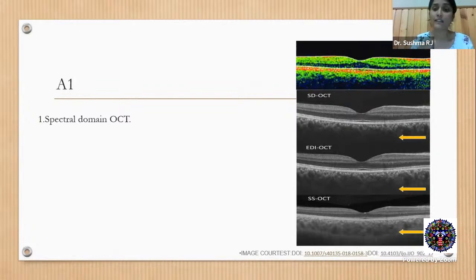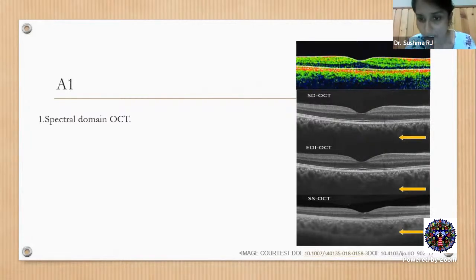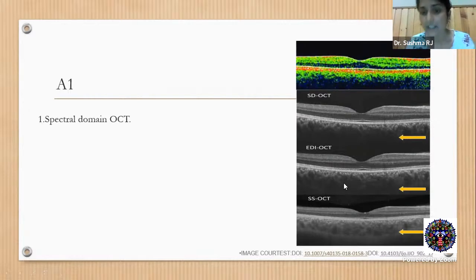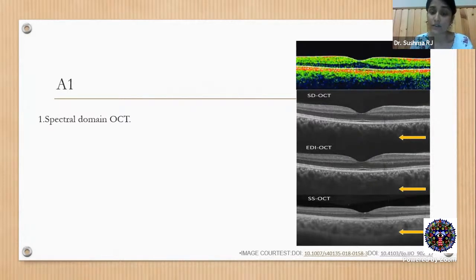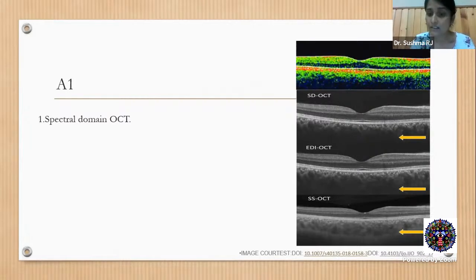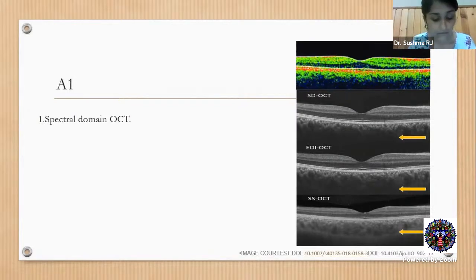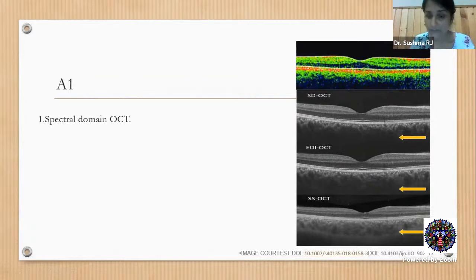In enhanced depth OCT, they shift the zero delay line from standard spectral domain slightly backward, giving a better picture of choroidal vasculature. Compared to standard SD-OCT, you'll have better clarity of choroidal vasculature in enhanced depth OCT. In swept source OCT, the choroidal vasculature is much more clearly visible all the way to the posterior Haller's layer. This is because of the wavelength used — 1060 nm — compared to normal around 800 nm. In SS-OCT, depth increases without losing resolution, so posterior choroidal layers are visible with greater clarity. This is how you differentiate each type of OCT.